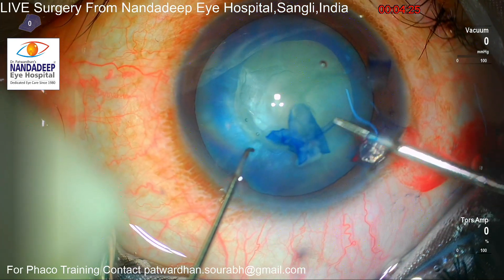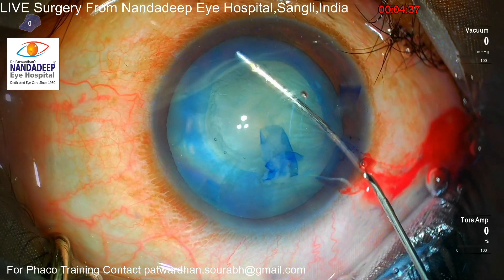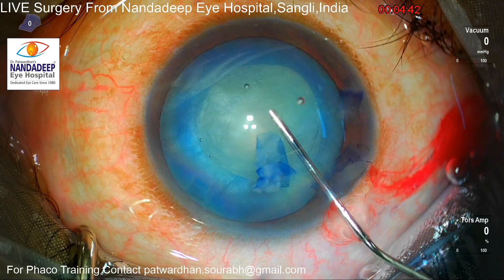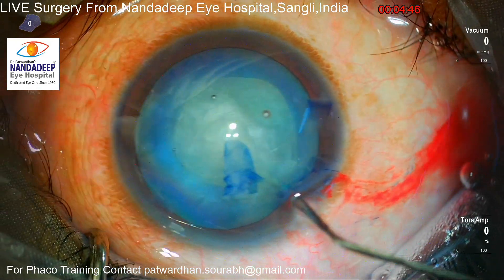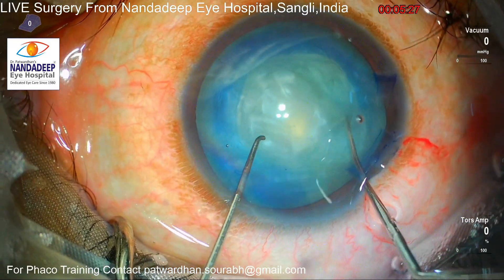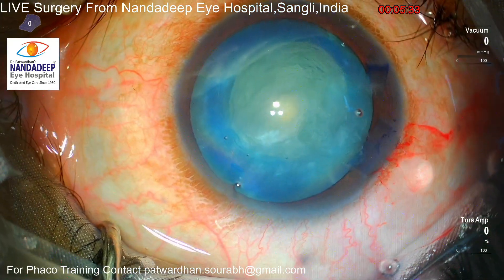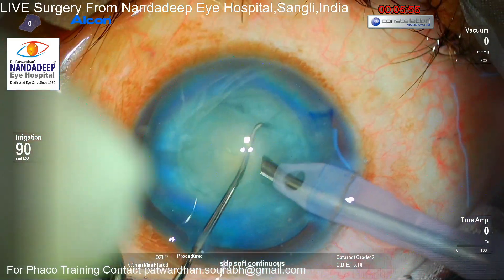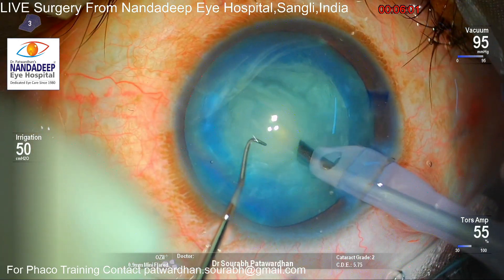There is also another way to remove this subcapsular fibrotic band, but in this case it was not needed. The capsulorhexis was slightly decentered, so I tried to enlarge it on another side, but it was already almost closed. If you go back and see the video at the start, you'll find that I centered this capsulorhexis around the limbus using the CCC marker, because with a mature cataract it's difficult for the patient to fix on the light.